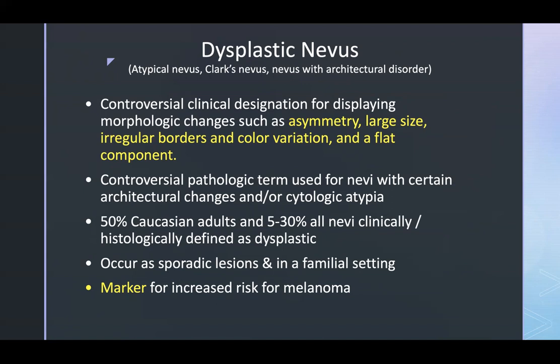So another reason it's controversial is if you were to give one pathologist a slide of a dysplastic nevus and another pathologist a slide of a dysplastic nevus, they would likely grade them differently. At least if you gave them enough, there's not going to be 100% agreement. And so it's important to know that it partially depends on the sections you're looking at, and it partially depends on the perception of the pathologist looking at the sections that are available for examination.